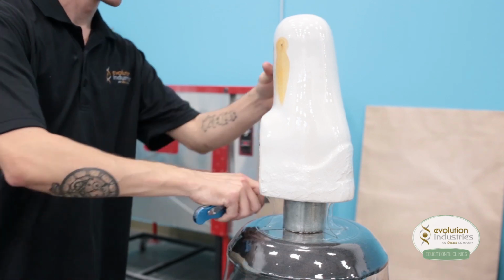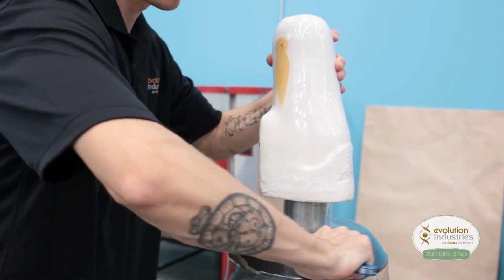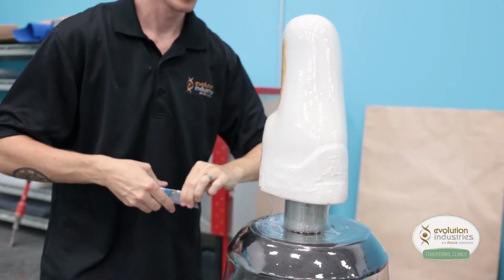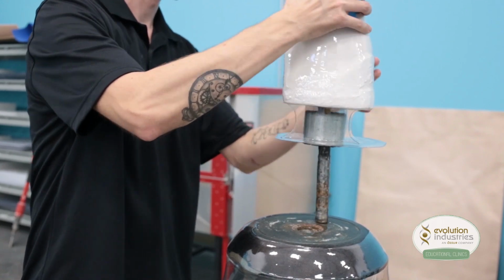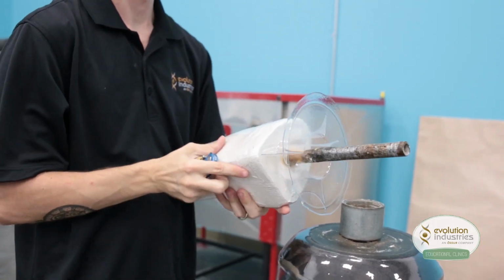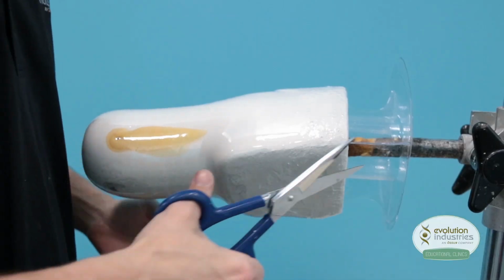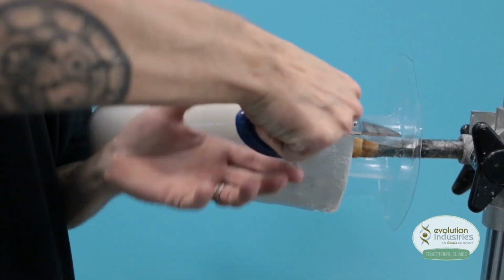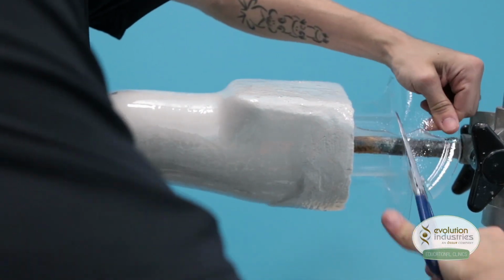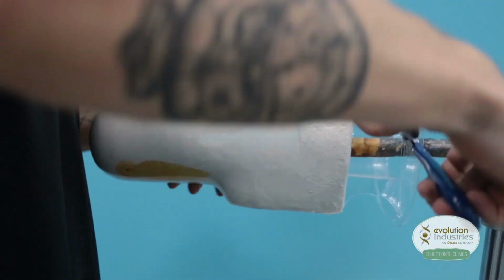Once your plastic is cool, you can use a sharp razor knife and cut it around the base. Couple little taps will release the collar, and then we'll go over to the bench where we will trim the excess off and heat and flatten the plastic. Using a sharp pair of shears, we're going to trim the PETG, leaving about 2 inches remaining that we will heat and fold down, and that will seal the top of the cast from any resin reaching the plaster.